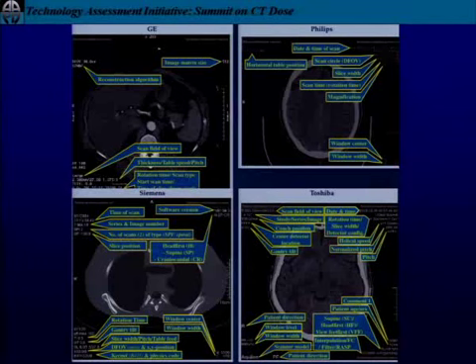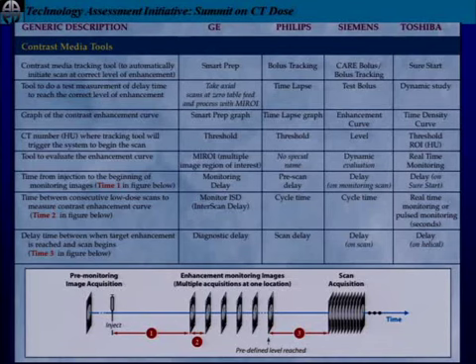If you even try to look at the images and someone brings you a film and it's a scanner you're not familiar with yet, and they say, can you look at this? I didn't like how it turned out. And you're sitting there trying to go, well, let's see, what slice width? You have to look at all these different places. So this is sort of a roadmap to the annotation.